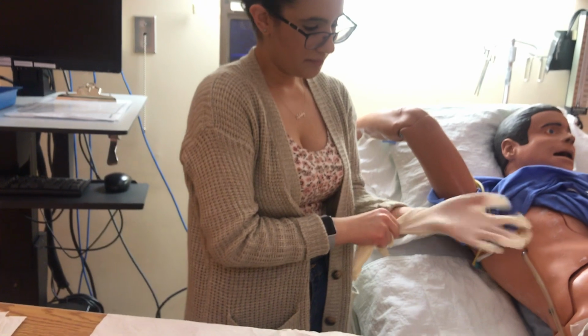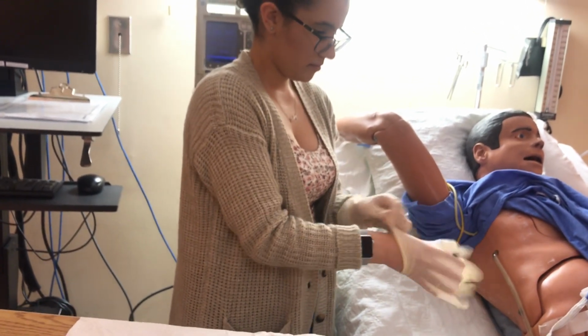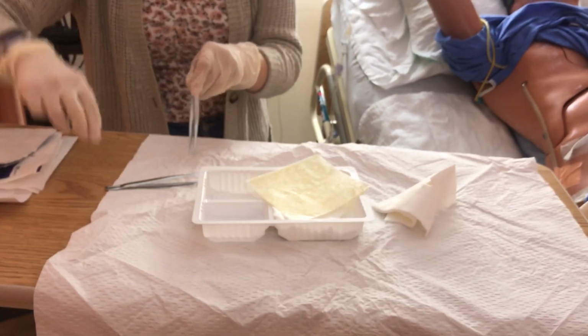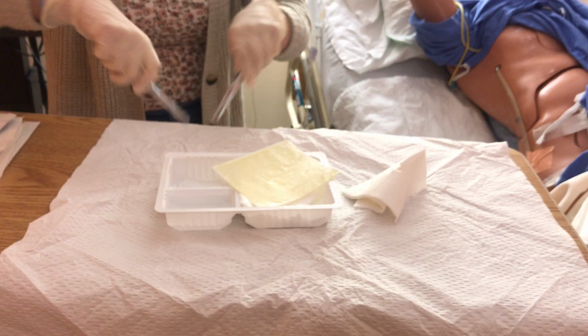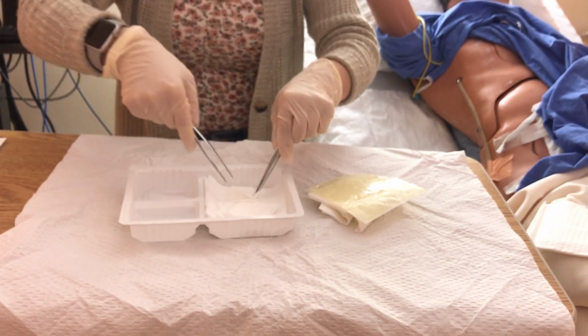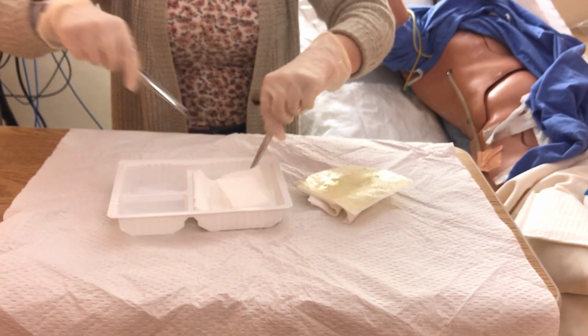So I'm going to program my pump here. So we want to option it. Primary, change mode. Okay. Label line. Go down to nutrition. Our rate ordered is 83.3 mils.